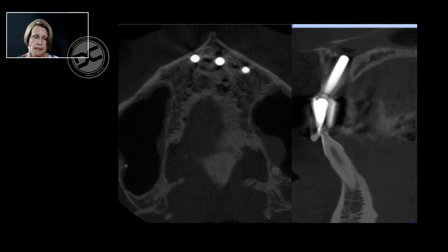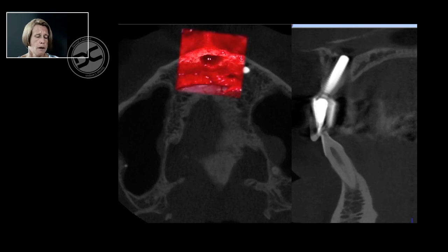The same is shown in this result. This patient received implant placement in the upper jaw, but suffered pain after implant placement for several years. When he consulted, we saw that the implant had been placed in the neurovascular bundle of the nasopalatine canal, thus causing the irritation to both the blood vessels and the nerve. Sometimes this neurovascular bundle is removed to allow implant placement in that area, but other reports indicate some neurosensory disturbances in specific patients.